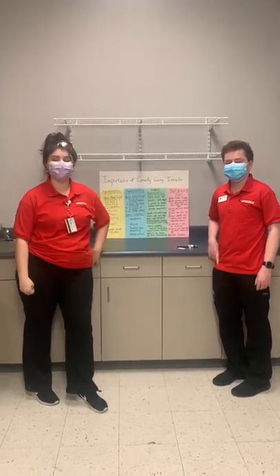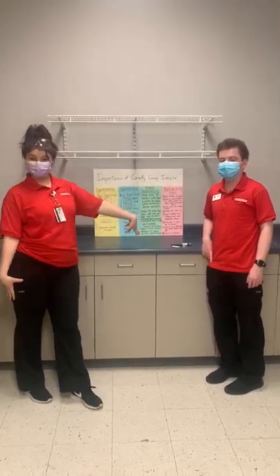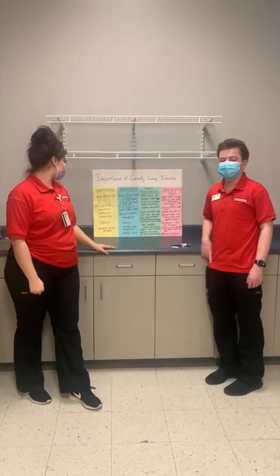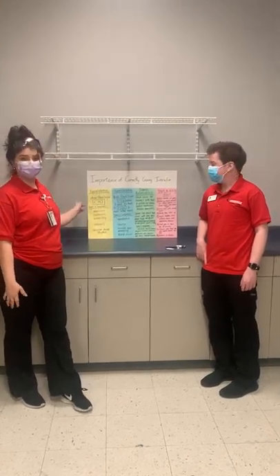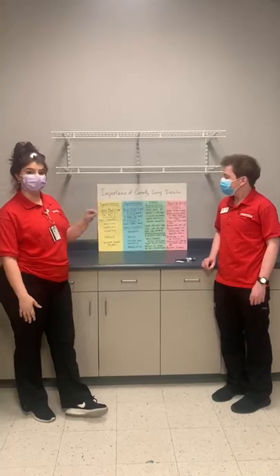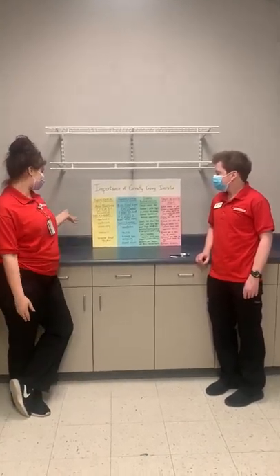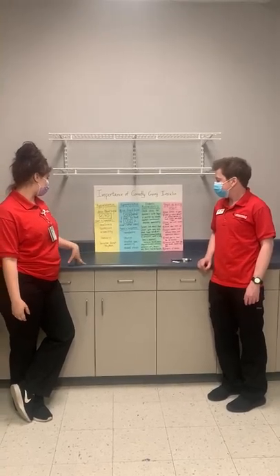Today we'll be talking about how to correctly give insulin and why it's so important. There are several side effects that can happen if you incorrectly give your insulin. One of those being low blood sugar, which is also known as hypoglycemia, and that is when your blood sugar level is under 70. Signs and symptoms of these may include drowsiness, confusion, irritability, shakiness, and irregular heart rhythm.